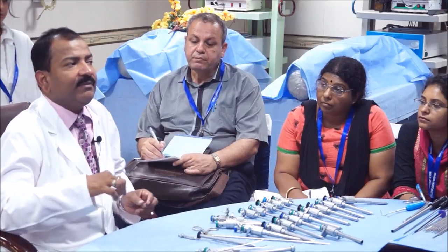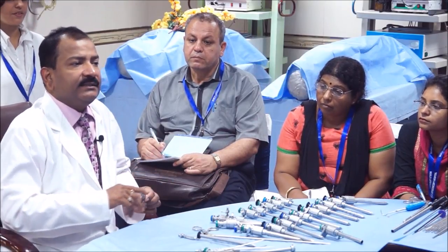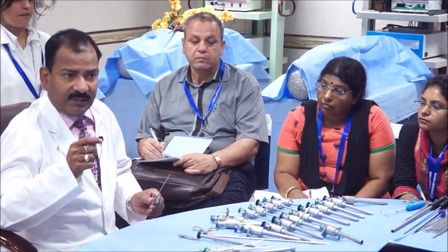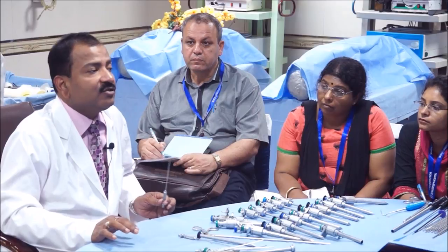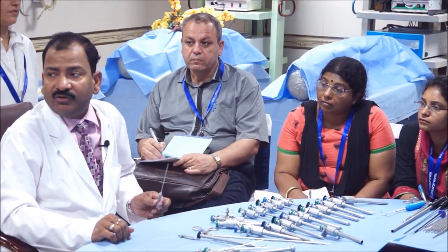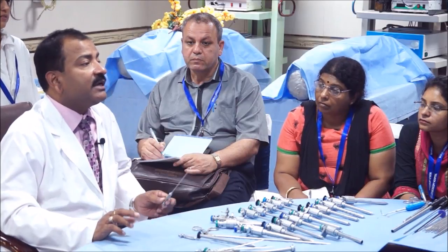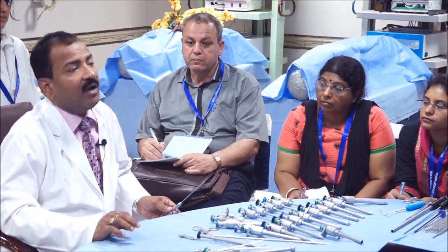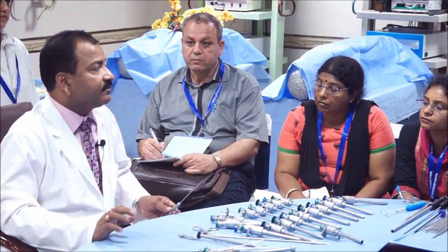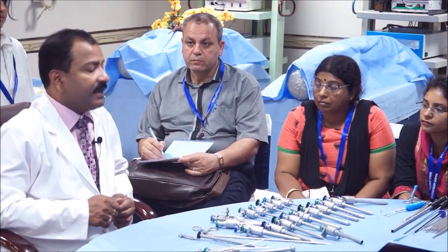One is name of different parts of the instrument. Second is uses of that instrument. Third, you have to learn complications that instrument can cause. Fourth, you have to learn what is the alternative of that instrument. Suppose I don't have it, then what I can do as an alternative. And fifth, how to clean and sterilize. This information is required for every instrument that we have.